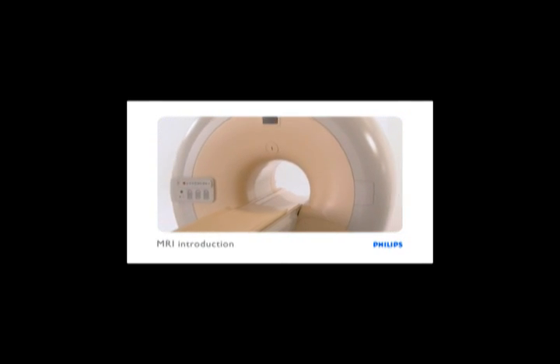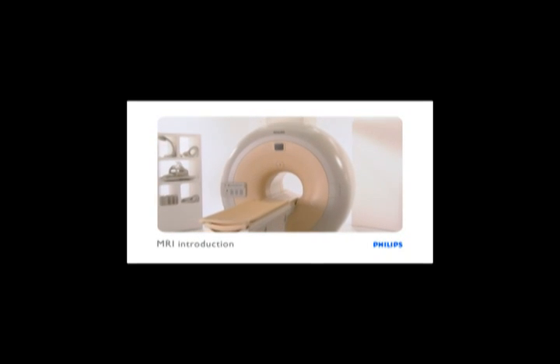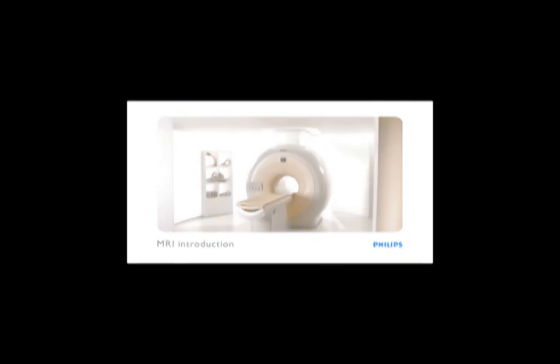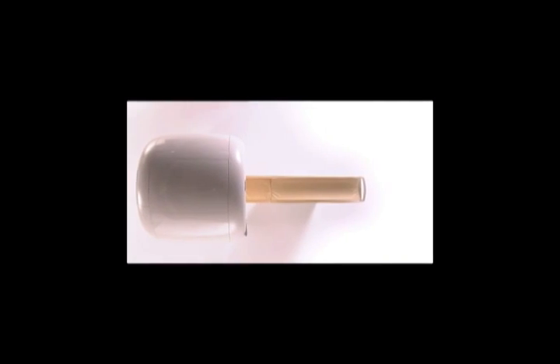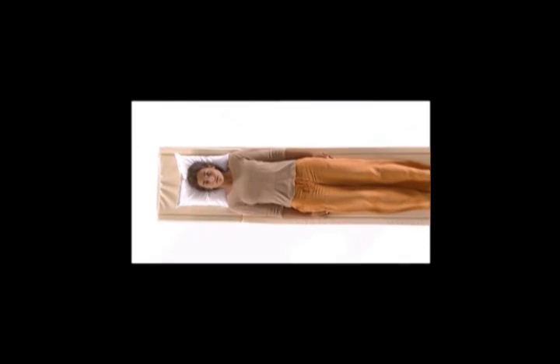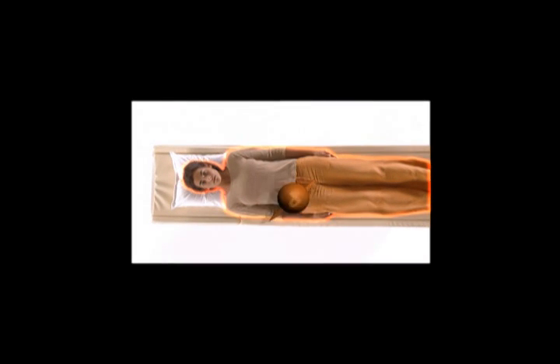Understanding the potential hazards of magnetic resonance imaging requires some knowledge of the basic principles. Living tissue contains a large amount of water, composed of hydrogen and oxygen atoms. Magnetic resonance imaging uses the nuclei of the hydrogen atoms, known as protons, to produce images. MRI can be used to show the position and concentration of the protons in the body, corresponding to the position of the various tissues as well as the tissue characteristics.